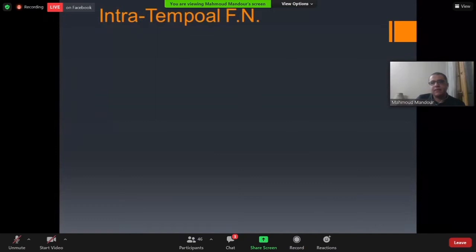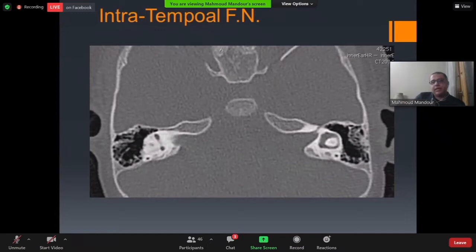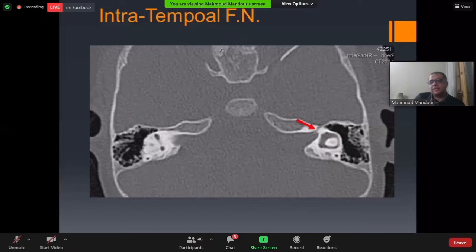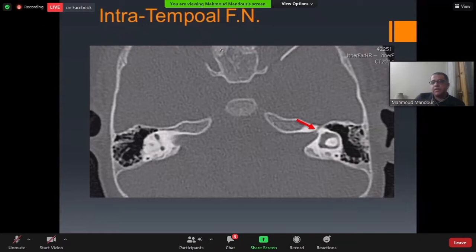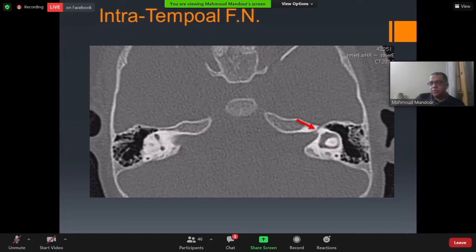For the intratemporal part, we examine CT. We start with axial cuts, particularly the cut where the labyrinthine segment begins to emerge from the IAC. An important point: to evaluate the facial nerve properly, you must examine it serially, starting from superior to inferior, to properly locate each segment.